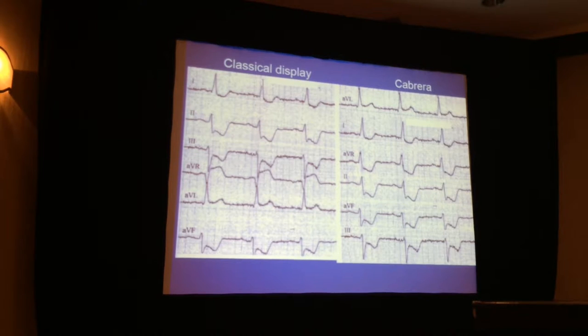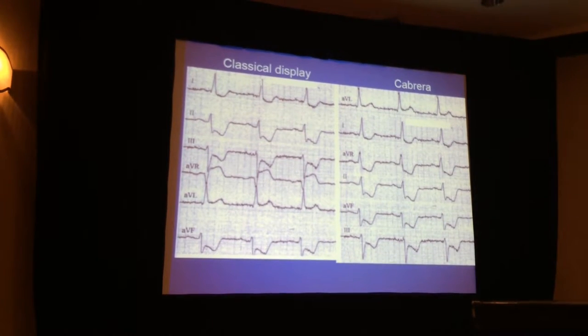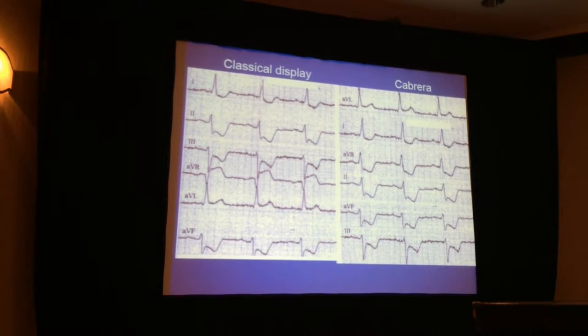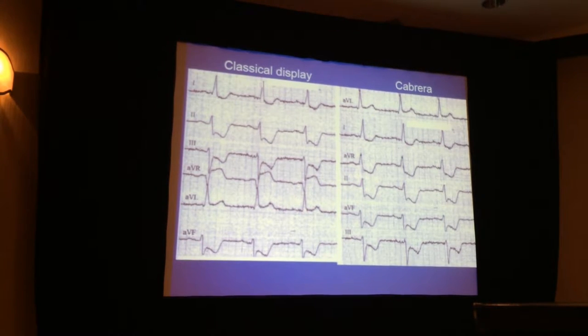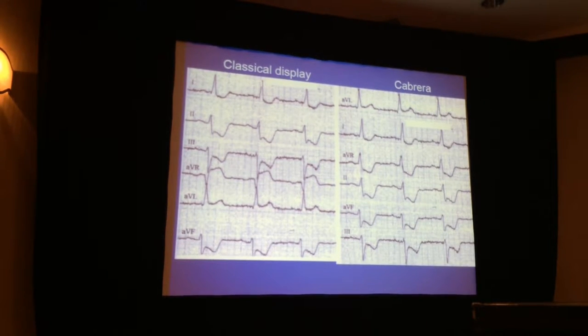anywhere. And the ST elevation they got is really just another lead with ST segments moving away from the left ventricle, in much the same direction as would be part of the scheme of a positive stress test, but a lot of it. So that would be one advantage of putting the ST elevation in aVR in context and helping you understand what's really happening to this patient.